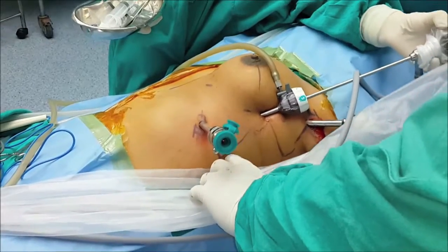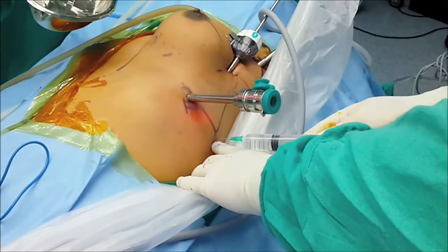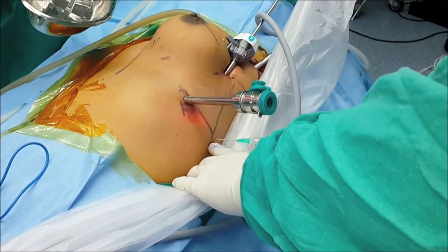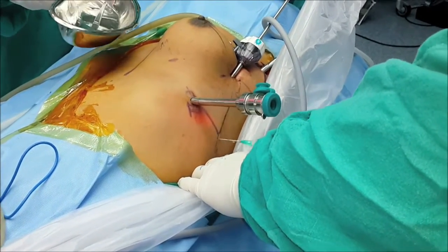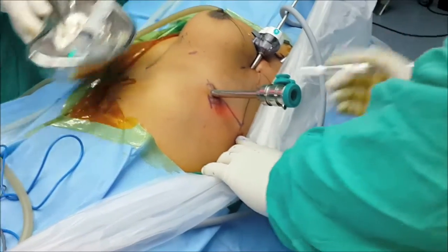Again, you see no torque whatsoever — completely free movements. This is the assistant port. You have two options: you can put this assistant port between the camera and R2, or between the camera and R1, depending on where you need it the most.